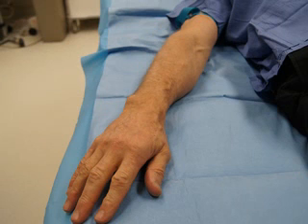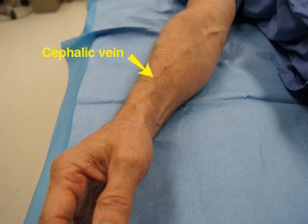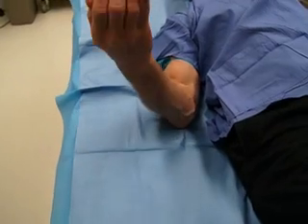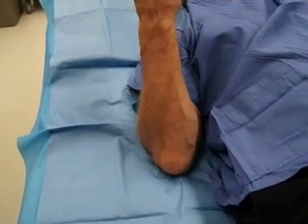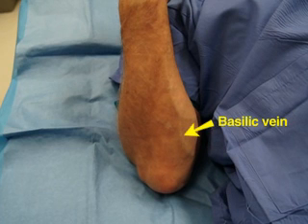To find the best site for an IV catheter, it is important to know the venous anatomy. The metacarpal and dorsal veins on the hand are good sites for initial cannulation attempts. The cephalic vein is usually prominent on the anterior radial aspect of the forearm. The basilic vein on the ulnar side of the forearm is often neglected because of its posterior position, but is usually prominent and often larger than the cephalic vein.